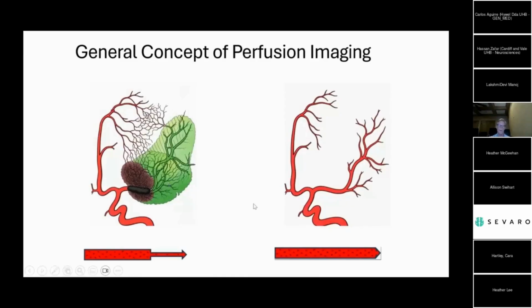the thrombus. Normal brain contrast and blood goes up to ICA, and then goes to the M1 and ACA, goes out to the brain tissue very easily. When a thrombus occurs, there's big trouble. So when a thrombus occurs, of course, the tissue is affected. We have our core infarct in this diagram as the maroon. We have the penumbra as the green.